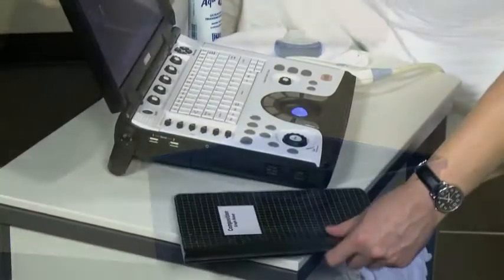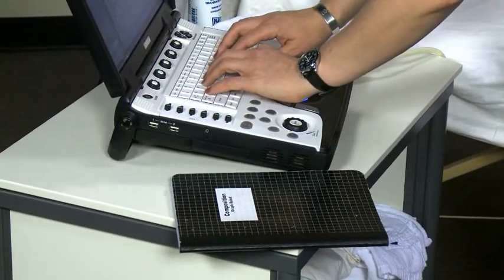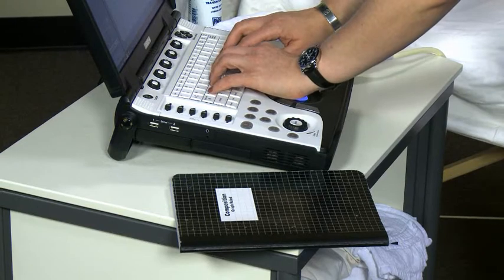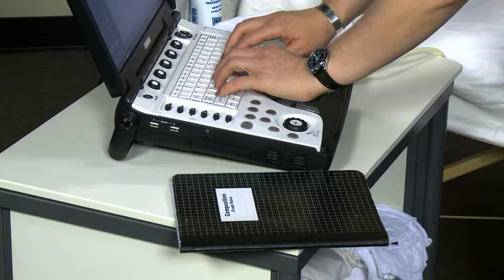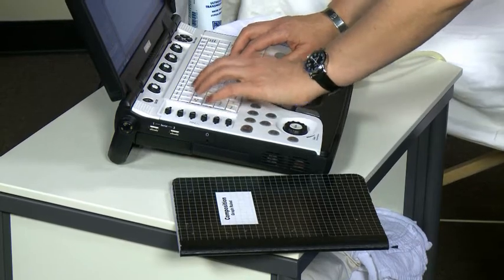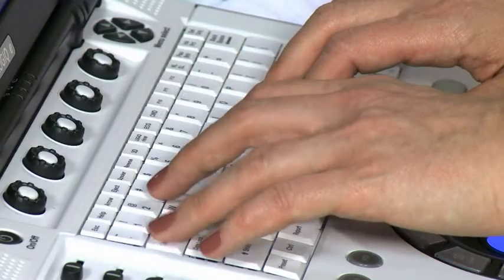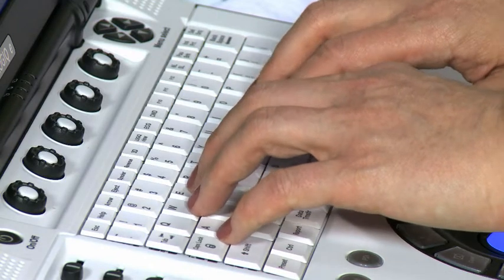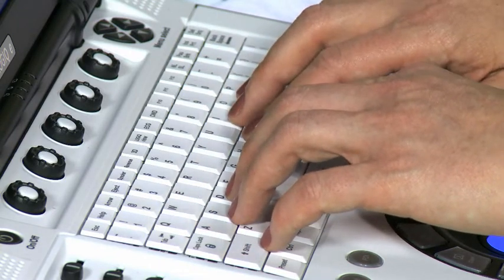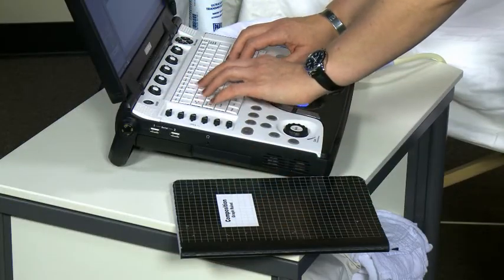Before you start your ultrasound, you must enter the patient's information into the ultrasound machine. This includes the patient's name, age, LMP or last menstrual period, and patient ID number. It is common for the patient to not know the answer to some of these questions. This is okay — simply leave the space blank and move on to the next question.